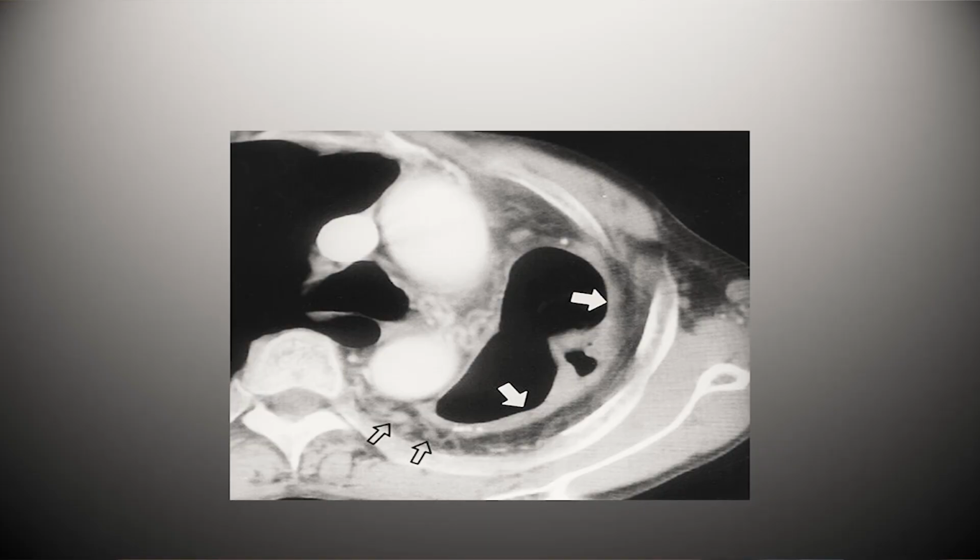So that is coming from the aorta, and we typically want to see that because that would help us when we go for the actual management. And again, more than the axial CT scan, if you get a coronal projection, that probably is better, because then you can very clearly see these serpiginous opacities. These are the vessels, these are the bronchial vessels. And then we want to look at the pleura. If the pleural space shows these again serpiginous opacities, these are usually abnormal, and there is importance and interpretation of that, why we want to see that.